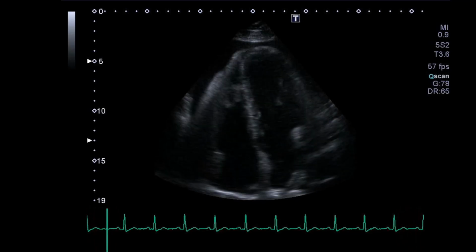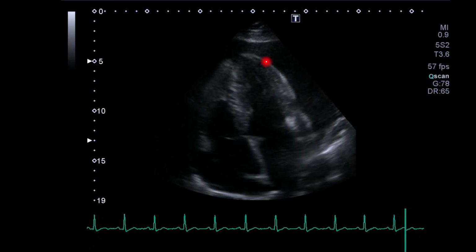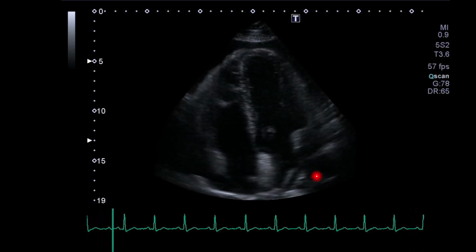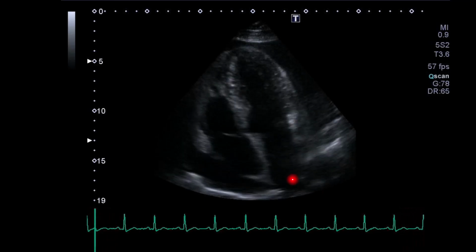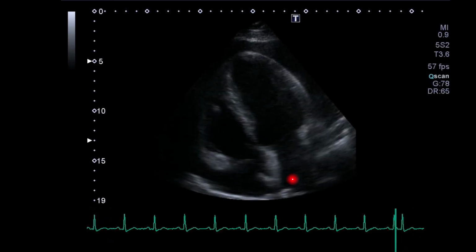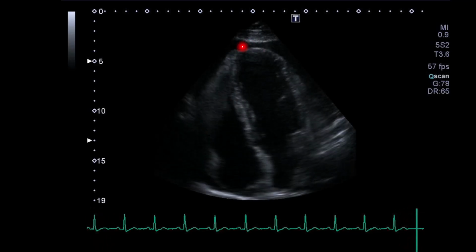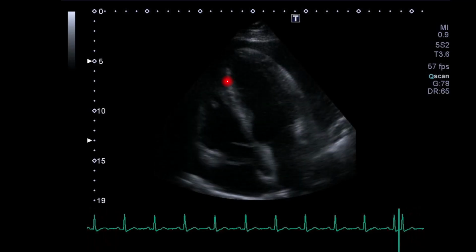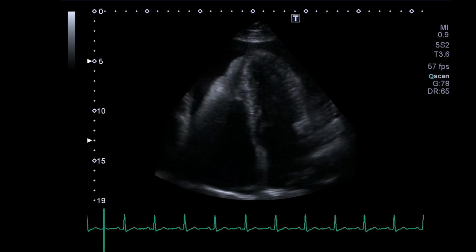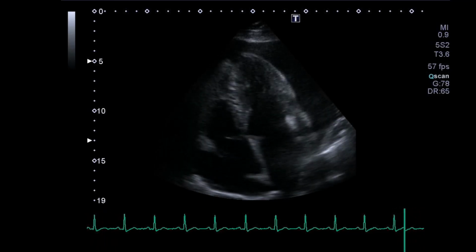Overall, the heart seems to be moving a little bit here as well. We can still see the strongest attachment down here, since there is very little effusion here near the left atrium. It seems to be moving more up here, but don't be deceived by that either. It may seem a bit more pronounced here due to the reverberation curtain than it really is.